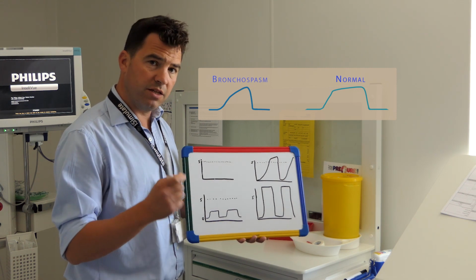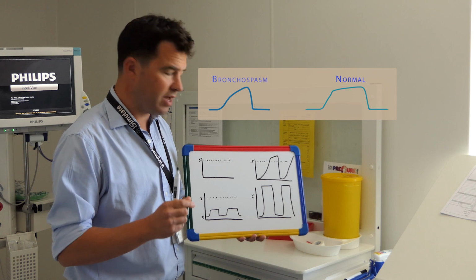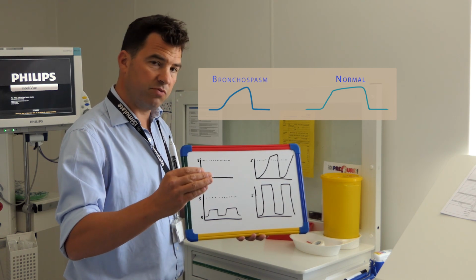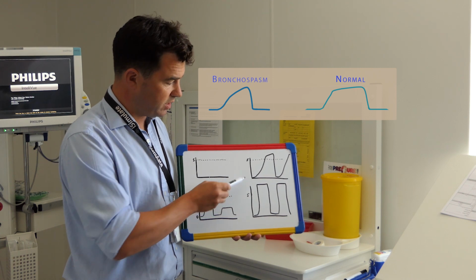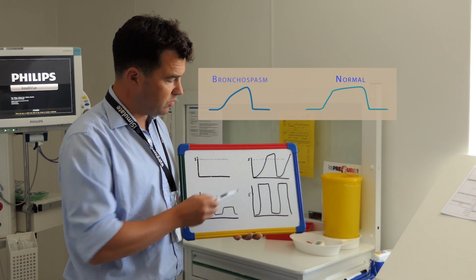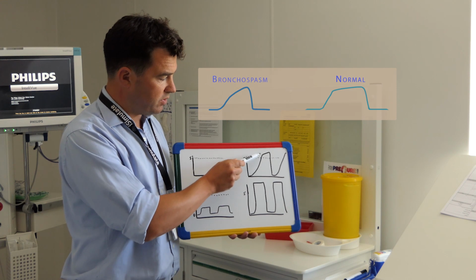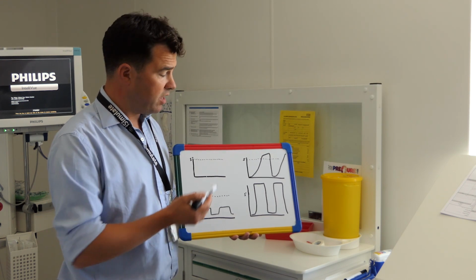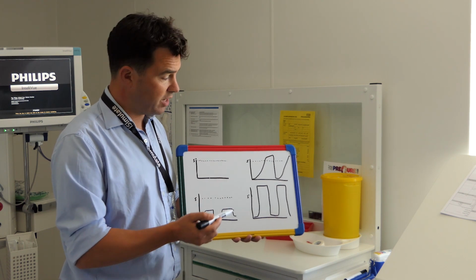That's because in the bronchospastic patient with narrow airways, they've got a slower expiration, as you hear them wheezing, and you can anticipate that with this sort of trace. So what you'd be thinking about there is your pre-hospital care, doing nebulizers, potentially IM adrenaline in somebody who may have arrested through asthma.